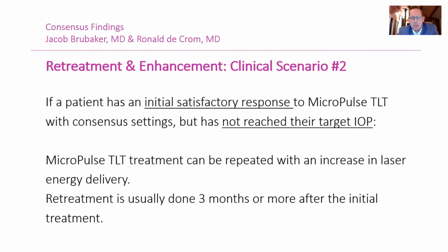Otherwise, if you have a patient who has an initial satisfactory response to your treatment, but your target intraocular pressure has not been reached, then you can also repeat your MicroPulse treatment, and you can also increase the laser energy delivery. Most of the time, retreatment is done 3 months or more after the initial treatment.